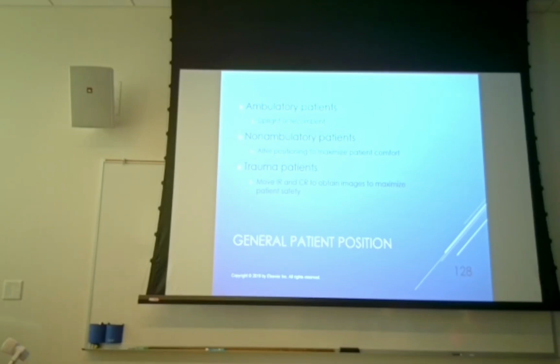Some of our procedures we're gonna do upright, but for standard normal procedures, I tend to do mine with patient on table. And trauma patients, we're gonna do a lot of cross table. Also with trauma patients, we're gonna do some things that are a little bit different.